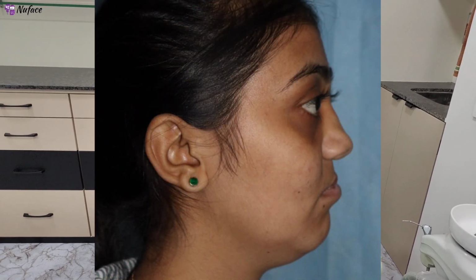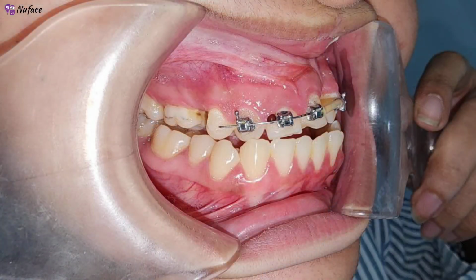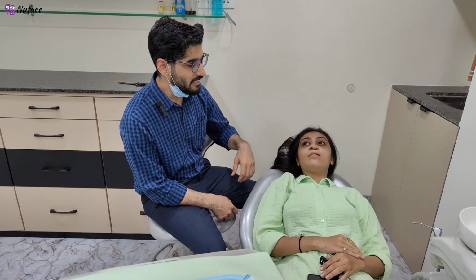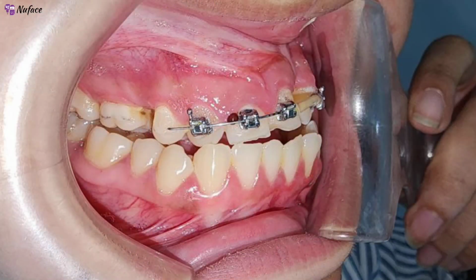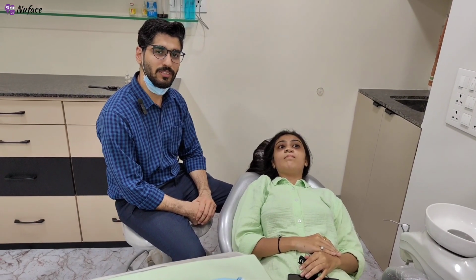So we have a 23-year-old patient today. She had a complaint of cleft maxillary hypoplasia, with her upper jaw being backwardly placed as compared to the lower jaw, and that is mainly because of the hypoplastic growth of the maxilla post cleft surgeries. As you can see, initially she had a negative overjet of approximately 4 to 5 mm with a positive lip step, giving a typical cleft maxillary hypoplasia look.